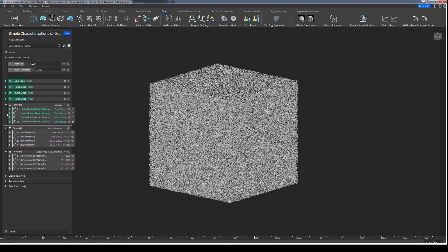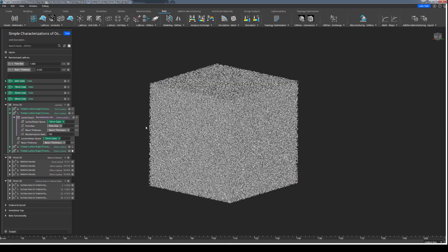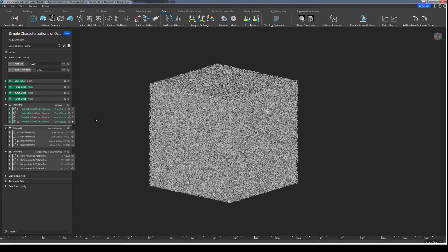These lattices all share the same randomization seed value, but realistically that doesn't matter here because the same seed value applied to a different volume will yield an entirely different variation in result anyway. Regardless, the two characterizations we are looking to explore here are relative density and the surface area to volume ratio.